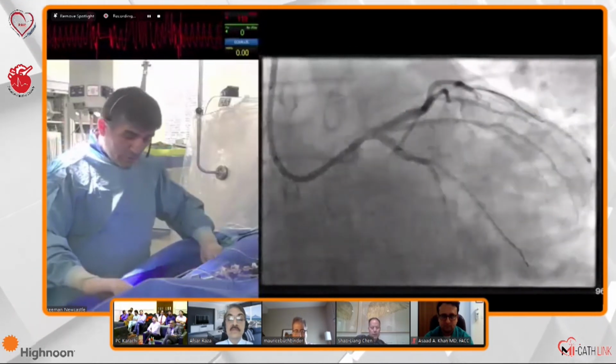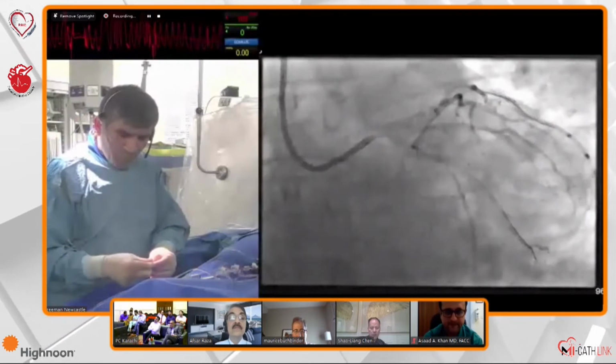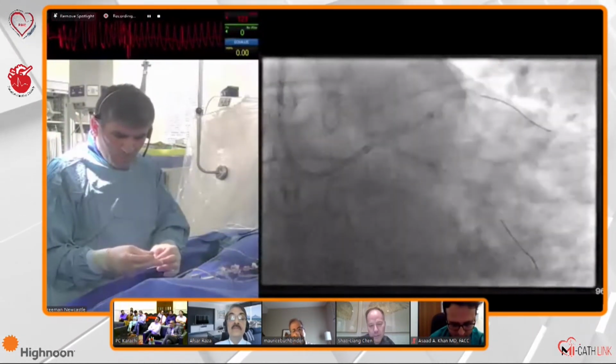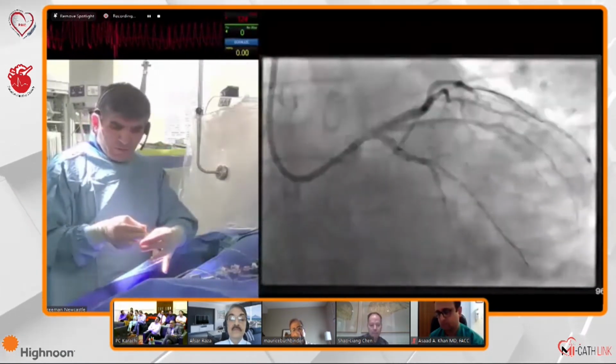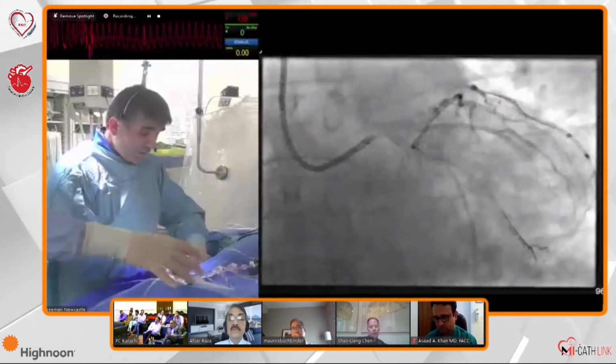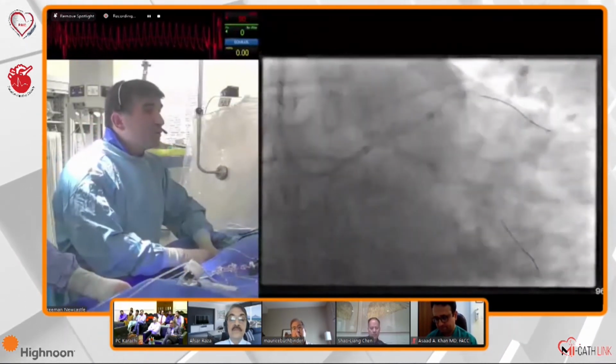The question for this stent will be under-expansion. So from IVUS, which shows the almost circular severe calcification in the proximal. Yes, pull this back. Yes, absolutely. And I said we still have a backup to do the IVL. You might have to stay with us for an extra 5-10 minutes, but if we need to, I think we'll probably be okay.